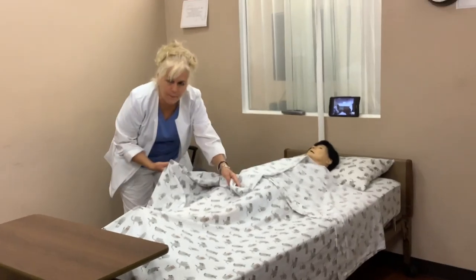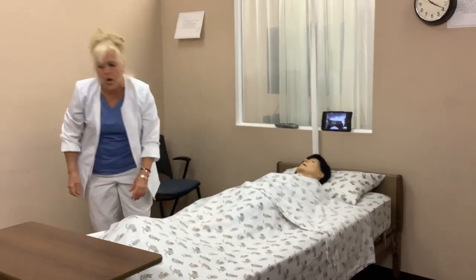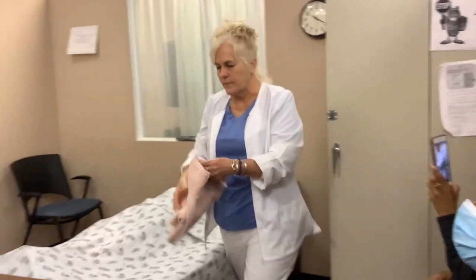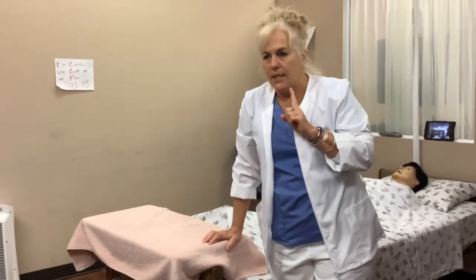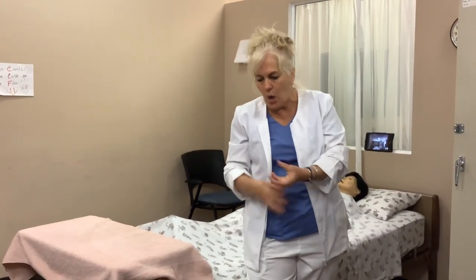Never uncover the patient. Check the name and get my supply. The supply is a barrier. You bring the barrier along, because if you bring all stuff together, you can touch and contaminate. They evaluate infection control in direct care — that includes infection control and safety. Infection control includes: don't touch anything improperly, how you use the glove, how many times you wash your hand, et cetera.